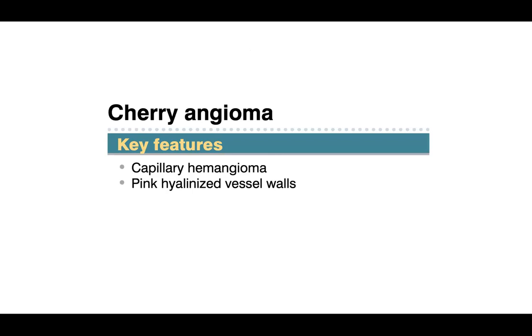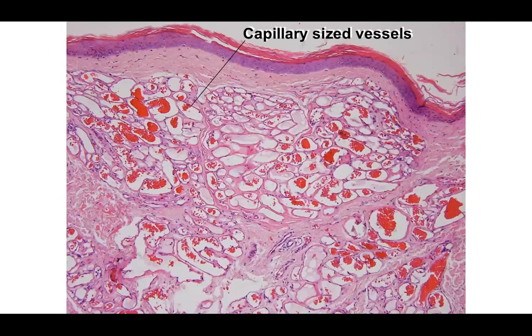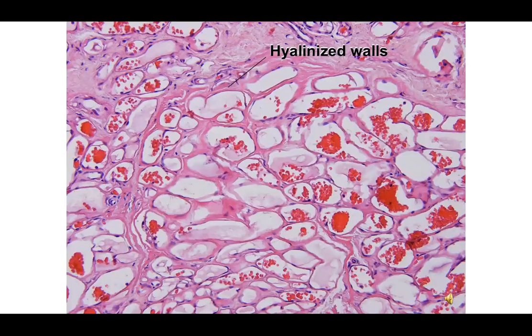Cherry angiomas are thought to be capillary hemangiomas. They have numerous thin-walled vessels, and you'll notice pink hyalinized vessel walls. Here's an example of the proliferation of those thin-walled capillary-sized vessels throughout the dermis. You can see the hyalinized nature of the walls between the lumens here.